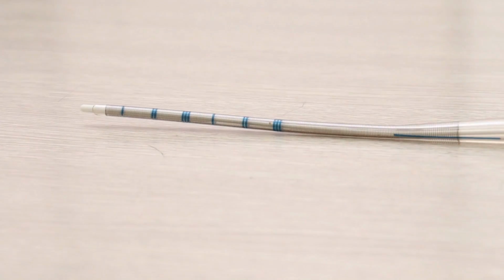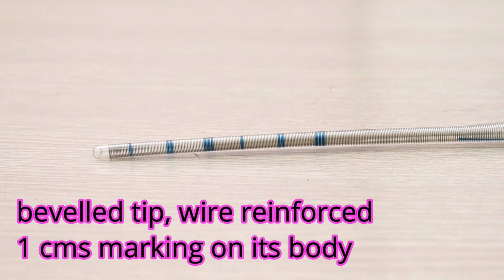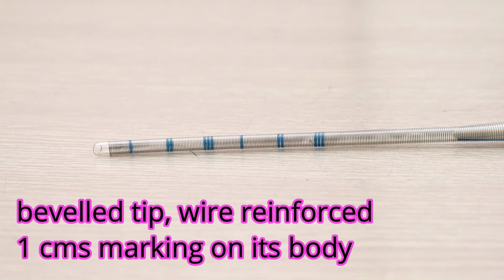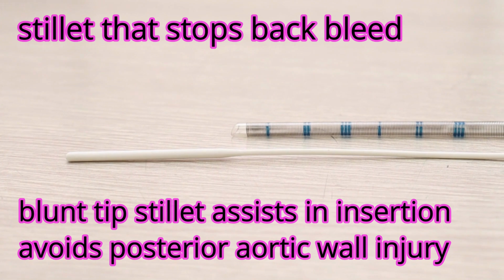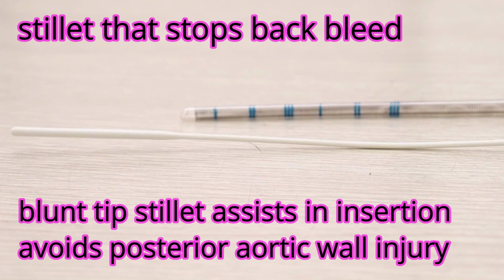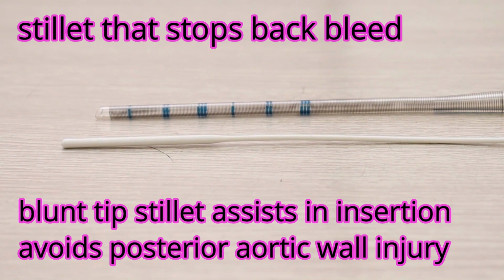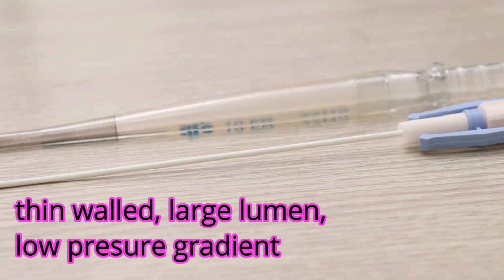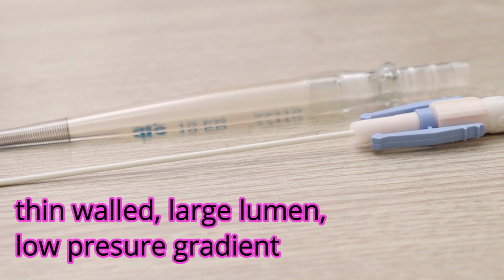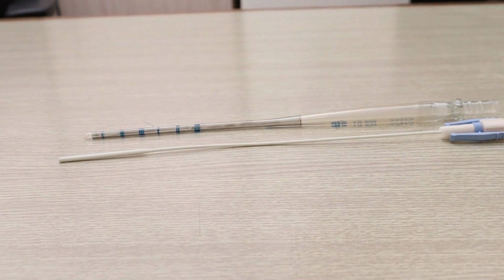Again, a beveled edge, which is meant for the arch flow. This cannula is meant for the ascending aorta, and as always has to be directed towards the arch. Now a much leaner type of arterial cannula, the one we use for pediatrics, is wire reinforced with markings 1 centimeter apart, and has a beveled tip. You can see the stylet is a bit broader at the bottom and thinner at the top, so that there is no bleeding when you put this cannula in the ascending aorta. Because this cannula is more slender and wire reinforced, you can still use it in the internal jugular vein, especially with the outburst of mixed cases.